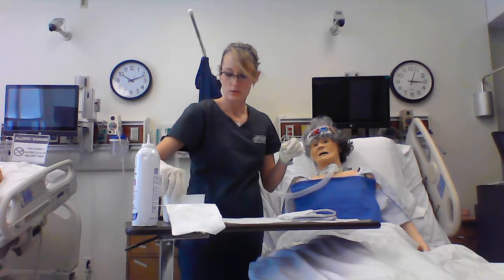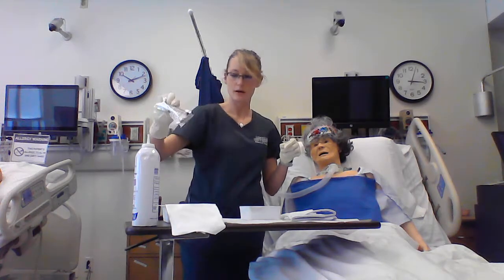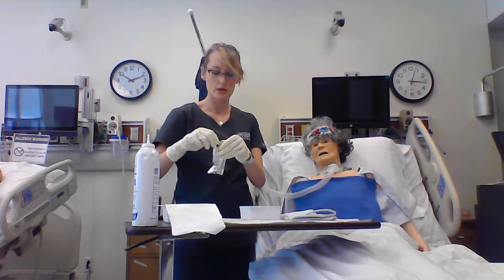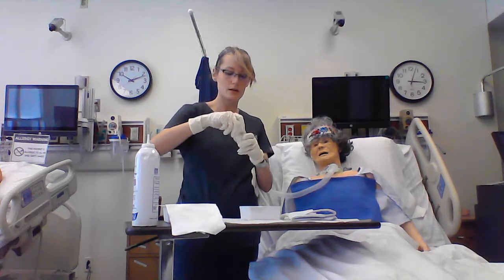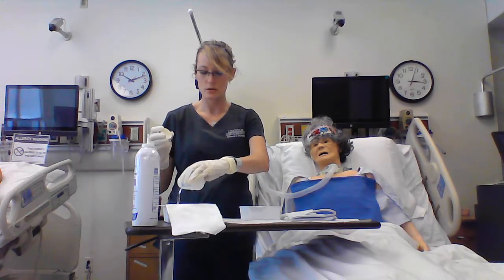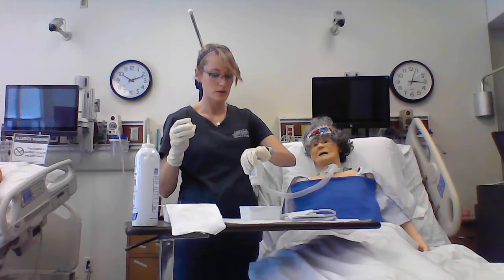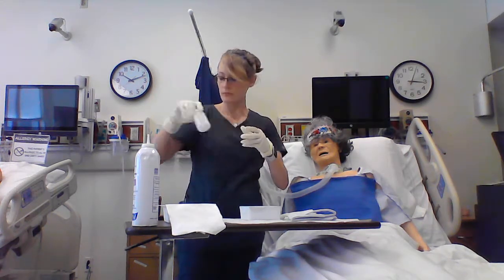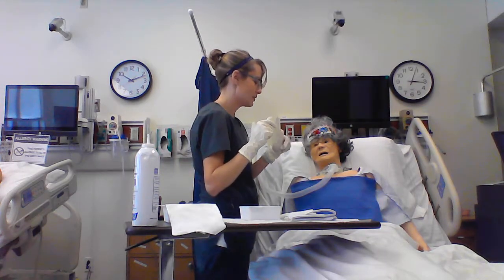These trays come with an extra tray for soaking, so I'm going to pull that out. And hydrogen peroxide, which I would open, dump into this container that I intend to clean in, throw that away. Comes with sterile normal saline, which I'm going to divide half and half between my hydrogen peroxide solution and then some to soak that cannula in once it's cleaned. Throw that away. So then we can get started.